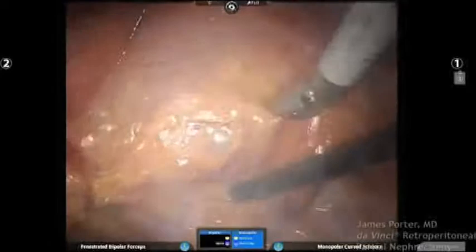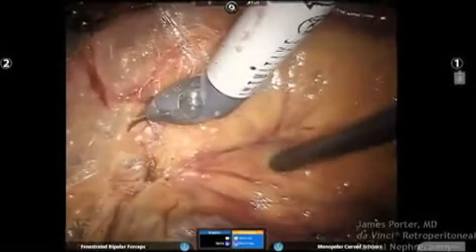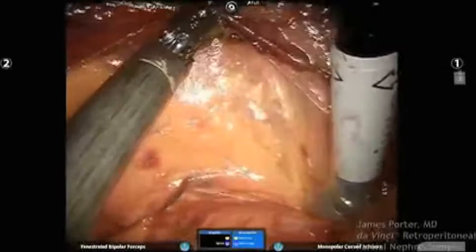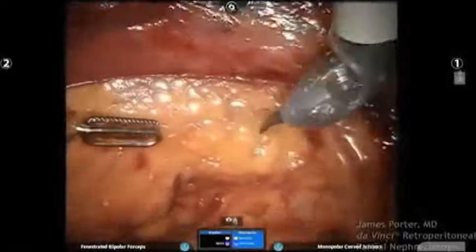And we've been able to get temperatures down to about 20 degrees Celsius to perform an adjunct in those special, not as a routine procedure, but kidneys, even with T1B lesions, to undergo protective effect during robotic partial nephrectomy.